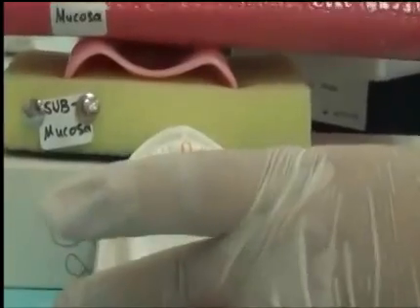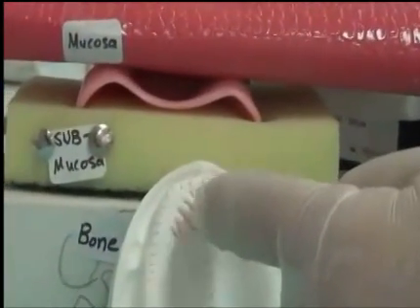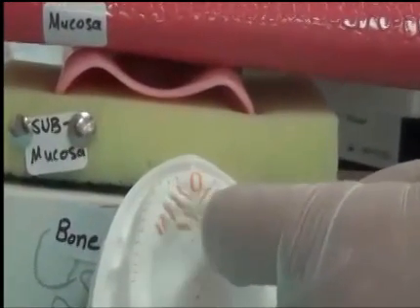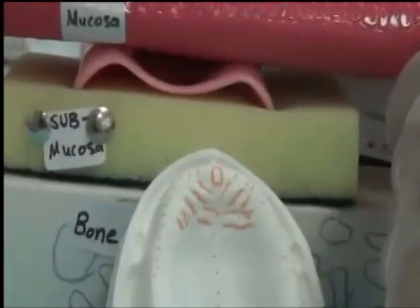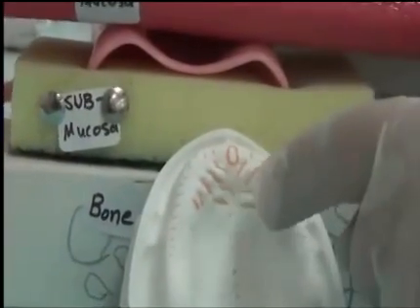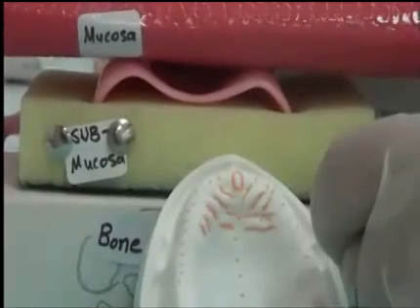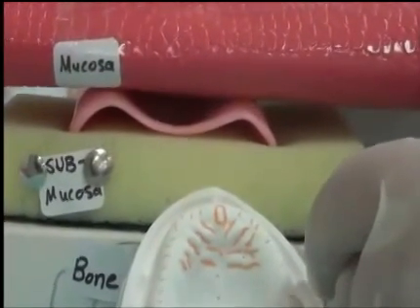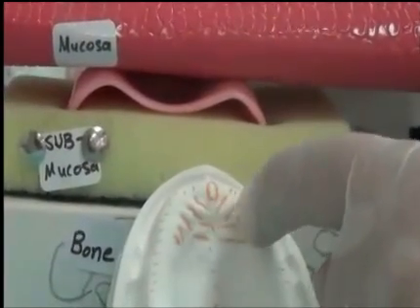And another reason why we need to relieve is the rugae areas here. This rugae area is a bit rough. This irregularity in the mucosal layer, or in the surface of the tissue, if under pressure, will be squeezed underneath the denture and will not tolerate the denture pressure, so we need to relieve the rugae area.